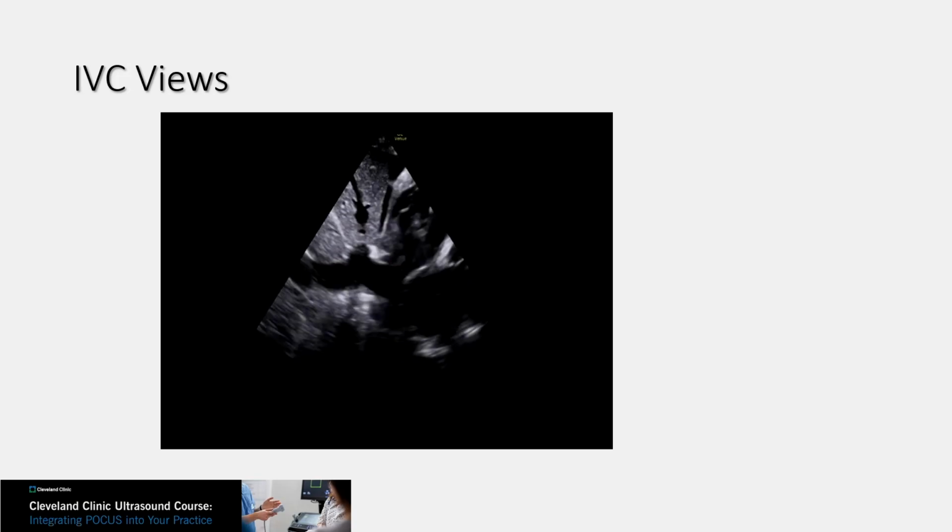This is a good example of the IVC, and you know this is IVC because you can see it entering the right atrium. You have a hepatic vein that is draining, and you can see during respiration not much change is happening with the IVC size.